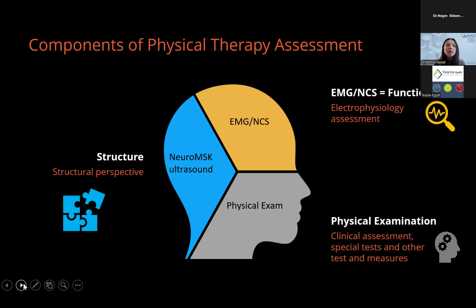It does not tell you about pathophysiology, or I would not say that all the time, because sometimes it does, but it does not tell you the severity grading, because the severity grading clinically does not correlate very well with the nerve size. There are some indicators, but in severity assessment, I would say EMG is the gold standard.